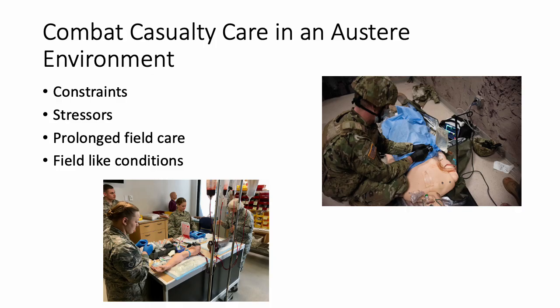These simulators can also model the impact of lack of patient evacuation capability and the need to conduct prolonged field care. This could mean progressive shock, infection, deterioration over time, and behavioral health issues. It is necessary that simulators are built to handle all weather conditions, dirt, and extreme handling like dragging a patient out of a combat zone or utilizing a buddy carry to get the patient to cover.